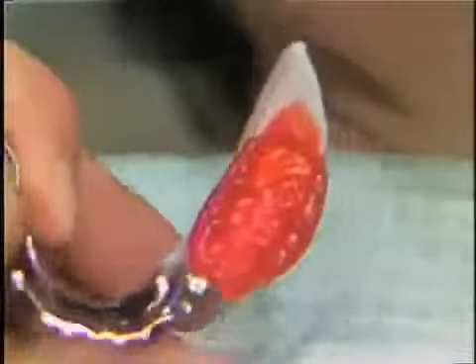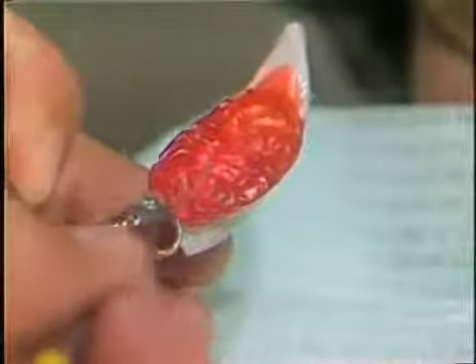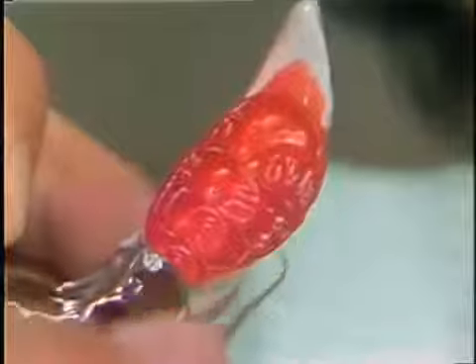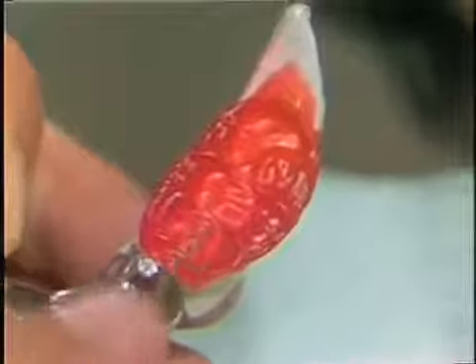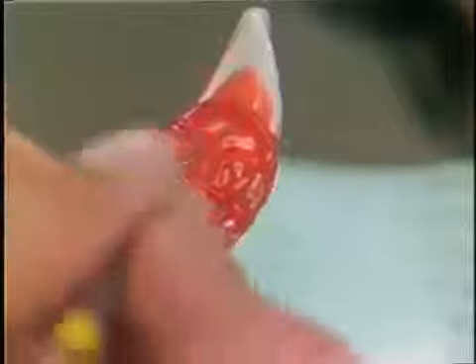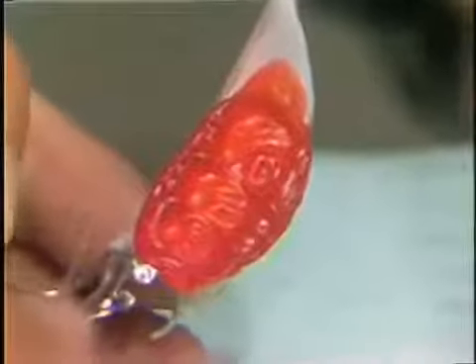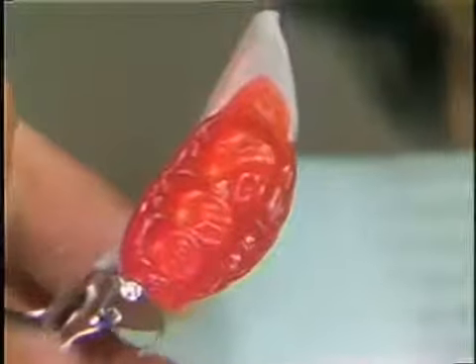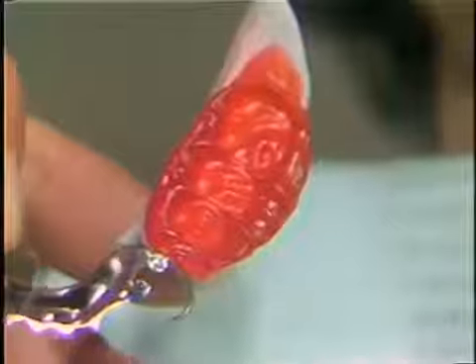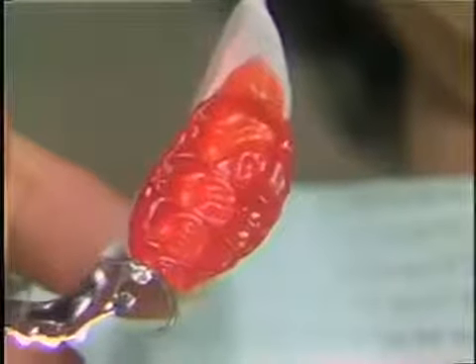Now what we are looking for is to see that the entire surface of each opposing tooth is in the wax. And we have a little border around each one of these indentations of these opposing teeth. Now this is the centric relation, centric occlusion recording for the patient.